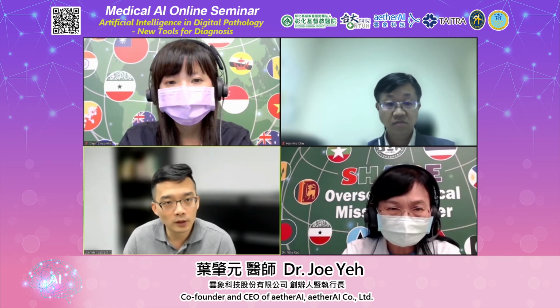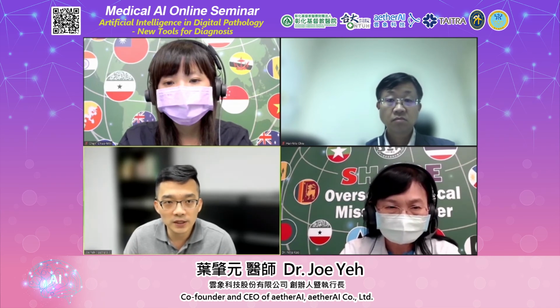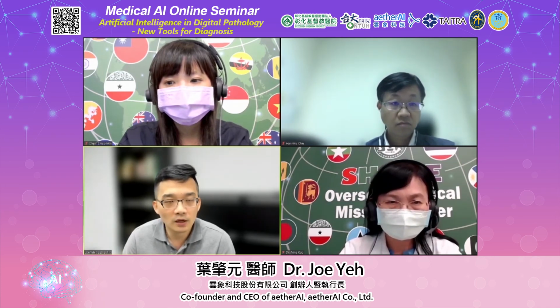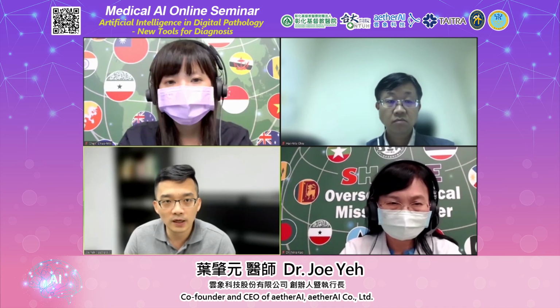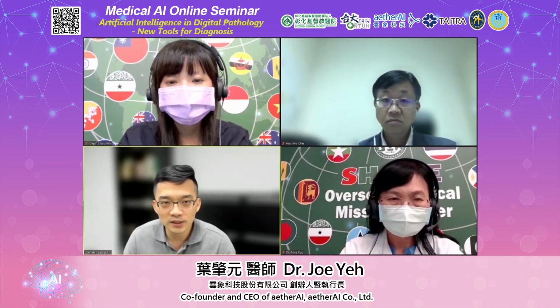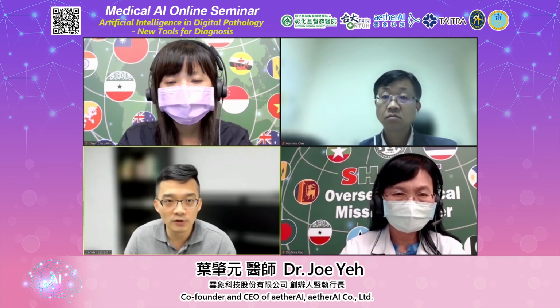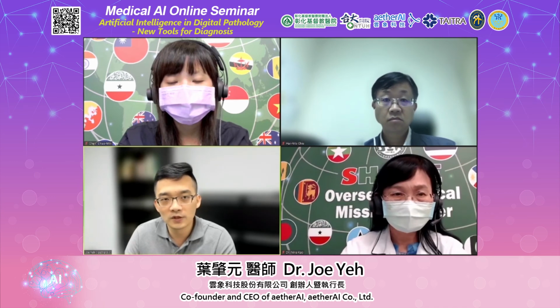We would take a two-pronged approach. To begin with, in the training data, we try to increase the diversity by collecting data from different institutions. And also we try to augment the image as much as possible. In the data augmentation phase, we also try to apply relevant data augmentation methods that can cover the diversity in the different institutions. So there's no magic bullet. Essentially, you have to increase the diversity in the training data and use ample data augmentation techniques.